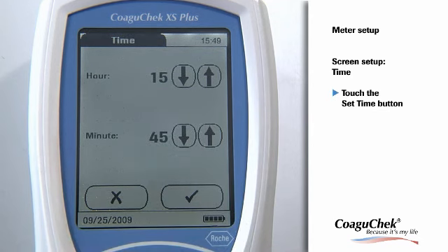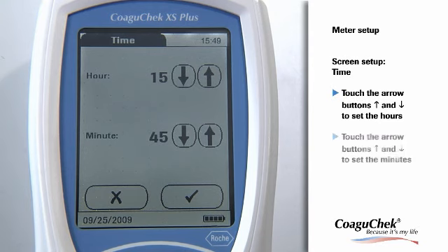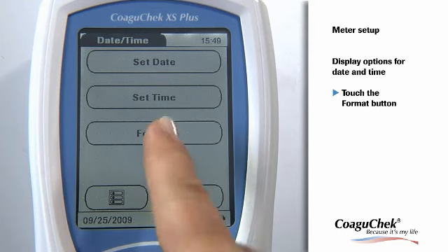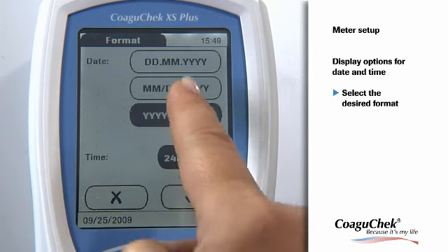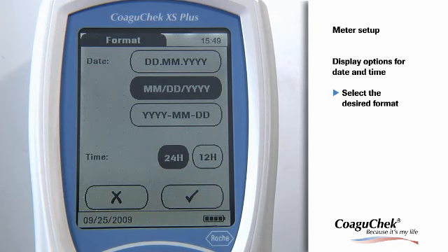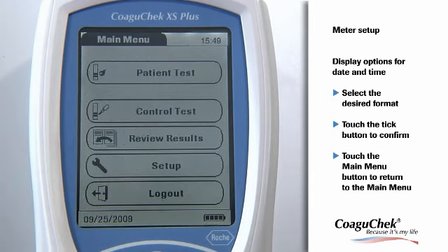Now please touch the Set Time button to enter your time settings. With the arrow buttons, you can adjust the current hour and the correct minutes. AM/PM settings can also be chosen here if you have selected the 12-hour format. After you have entered all settings, please touch the Tick button to confirm. The program automatically returns to the Date Time menu. Here you find a button for Formats, which leads to the Display Options menu. Select the desired format by touching the corresponding button. When the 12-hour format is chosen, AM/PM will be available in the Set Time setup. With the Tick button, you can save your setting, and you get back to the main menu by touching the Main Menu button.